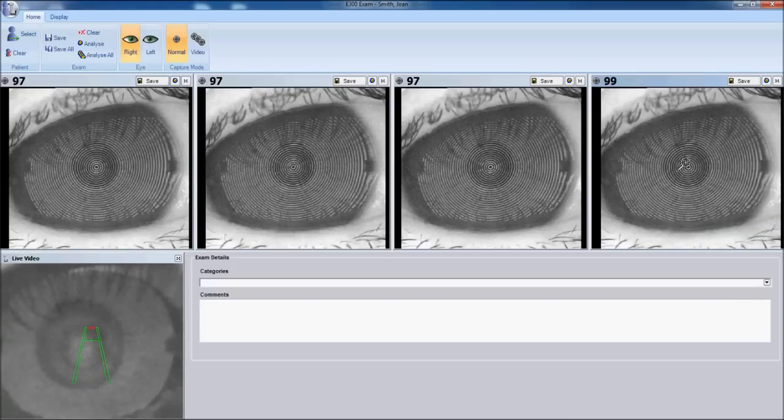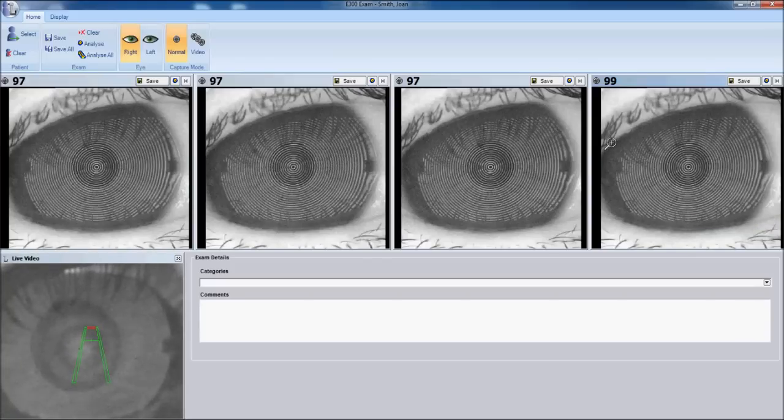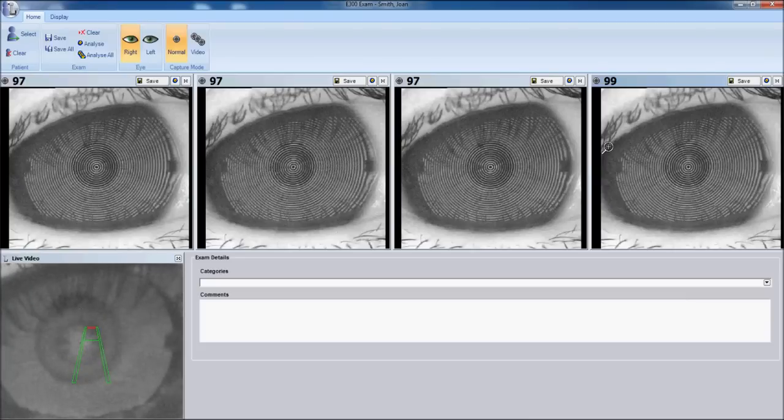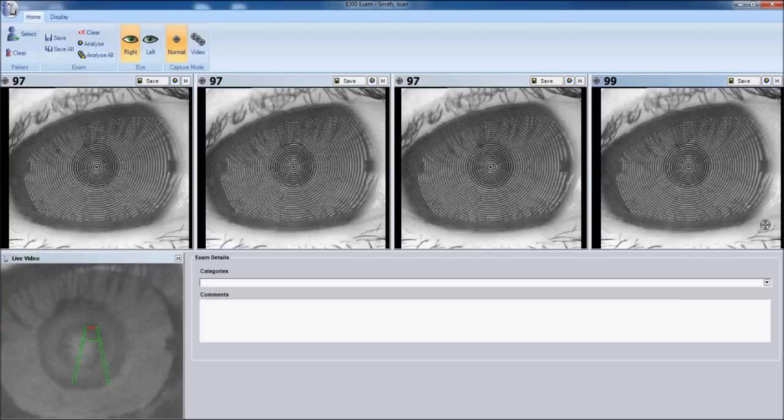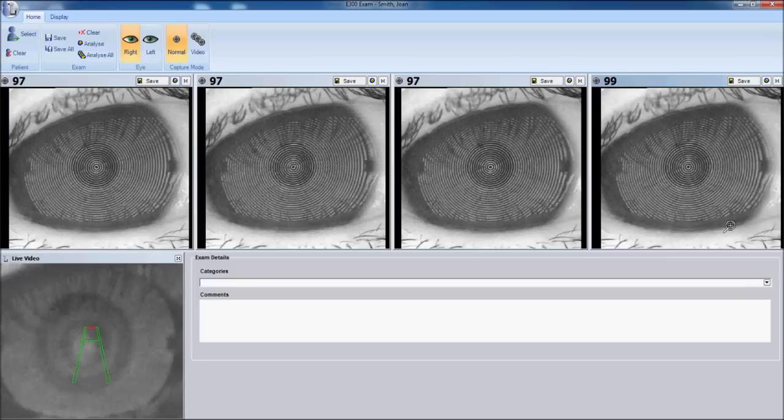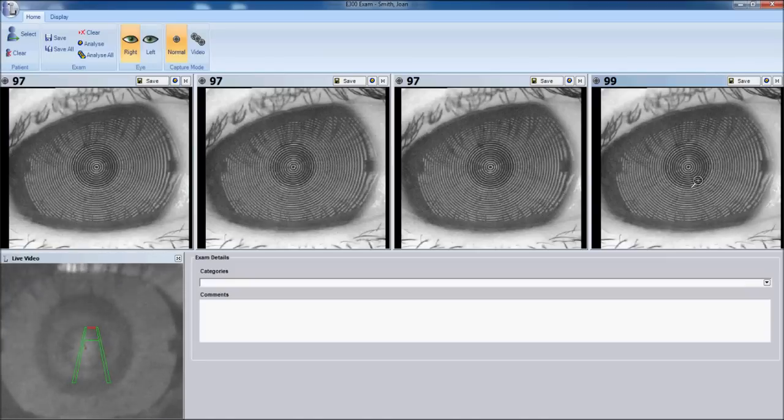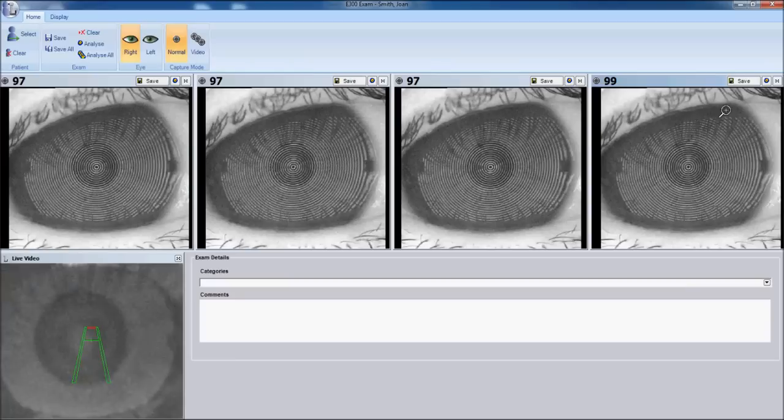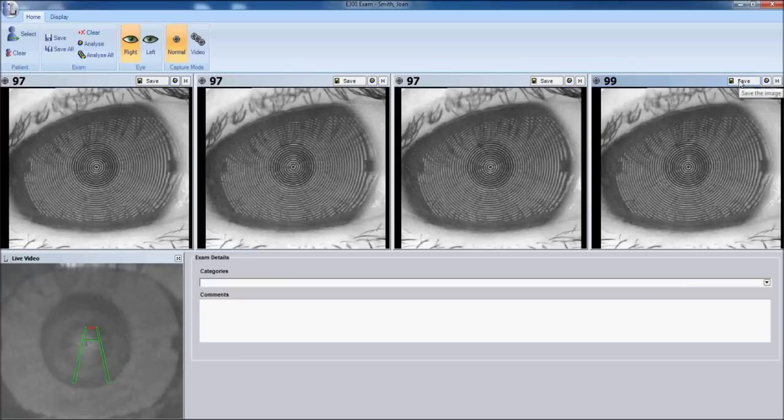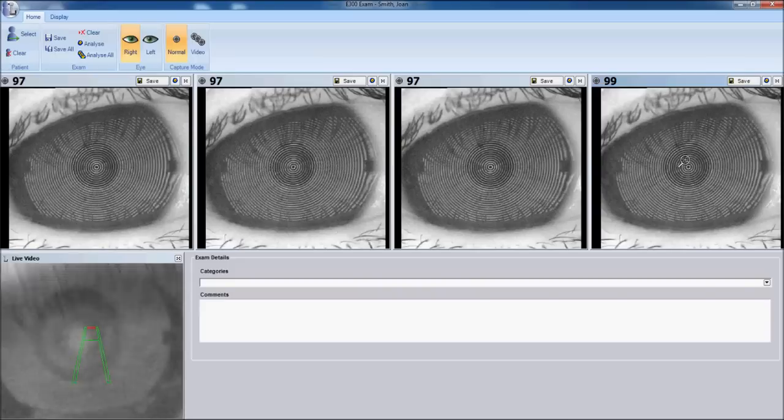We could save this image. However notice the upper lid is crossing approximately 30% of the upper iris. And the lower lid is crossing about 20% of the inferior iris. We should ask our patient to open up wider to get a larger fissure capture. Before we click the save button and save the image to the file.